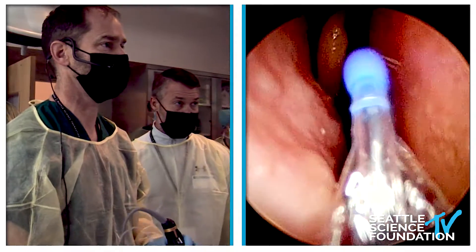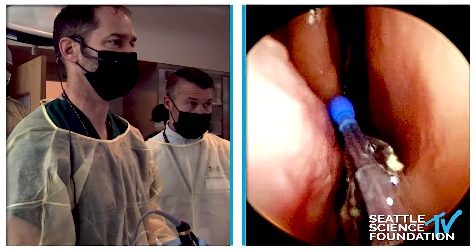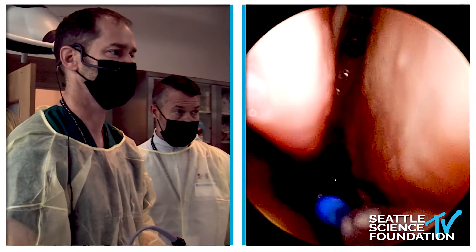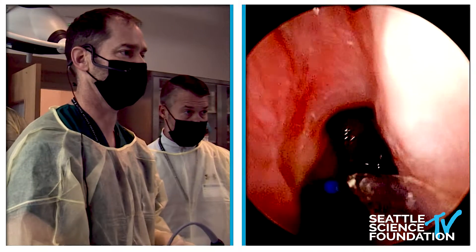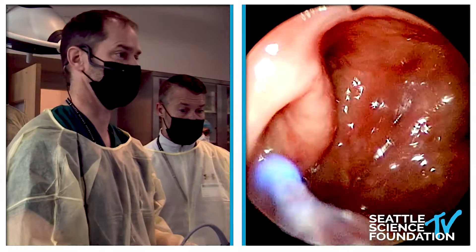The first thing I want you to do when you get to your head — and they're not a science, you can just grab a head anytime — but please take time to scroll through your CT scan, because I'll come around and ask you about your frontal ethmoid cells and make sure you are doing it right.